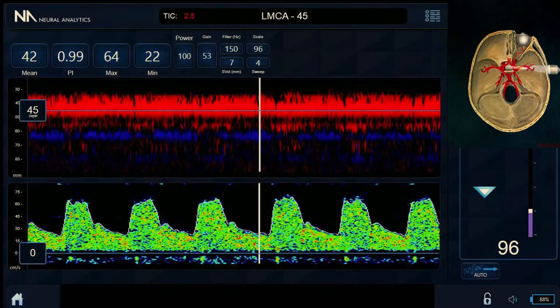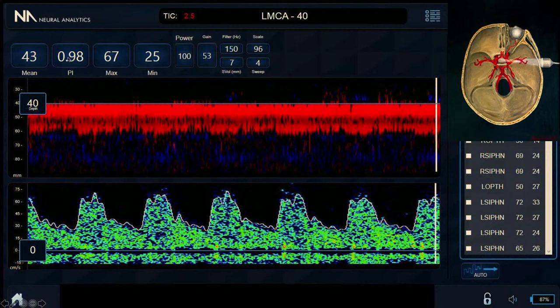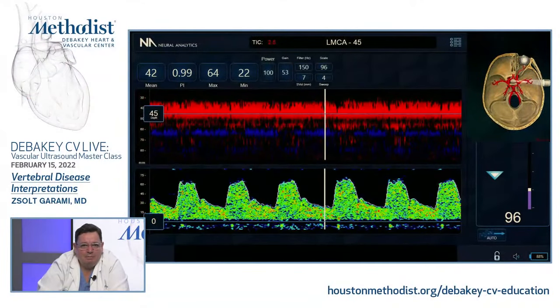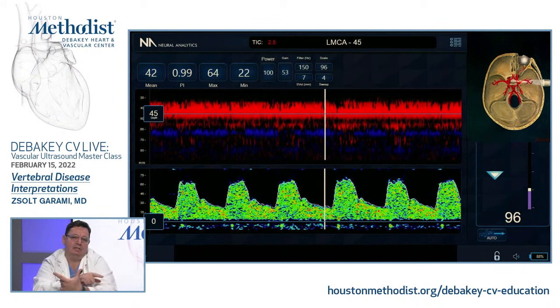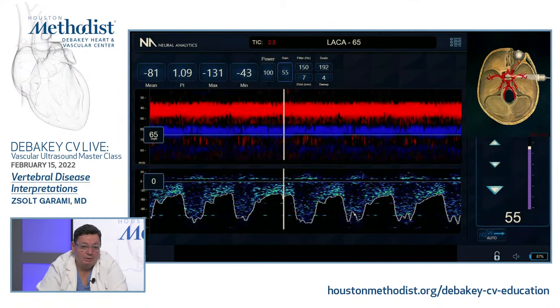On the left side, the MCA has a beautiful strong signal — the whole waveform fills up, M-mode is continuous. At depth 40, reading the mean flow velocity and PI values: the ACA is increased. When the ACA is higher than the MCA, that's flow diversion — the ACA is sending collateral flow to the other side. The MCA is only 40 cm/s but the ACA is 80 cm/s, telling me the left ACA is carrying flow from left to right as a potential collateral. That collateral has a bruit — a flow gap in systole visible at depth 70 from turbulence in the vessel.